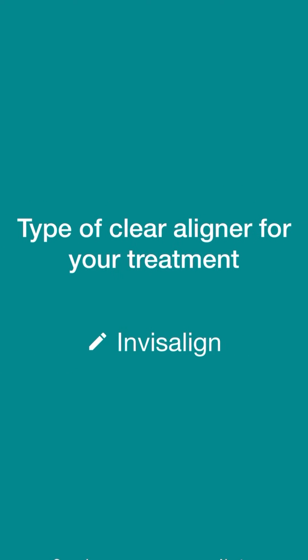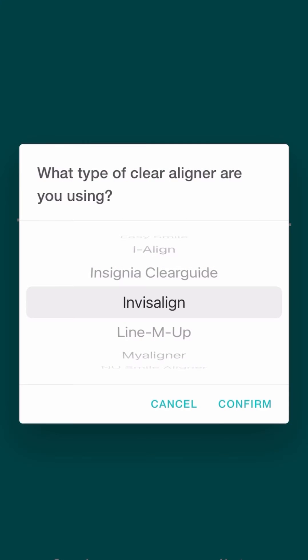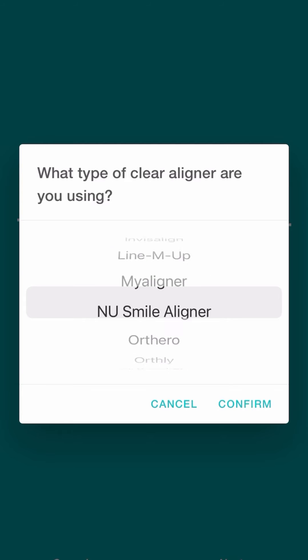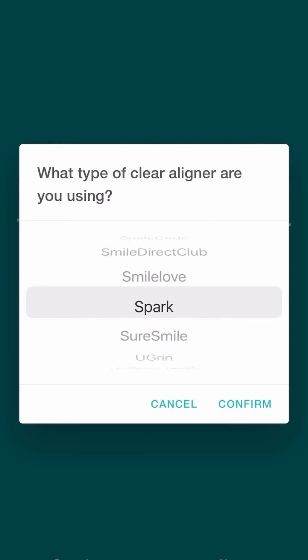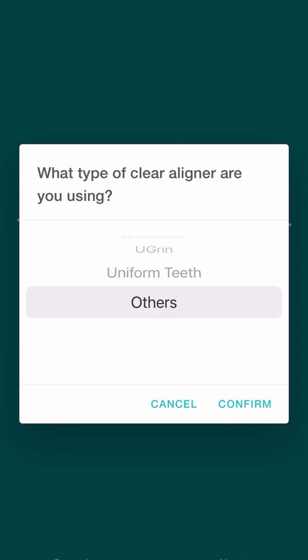This is where you select your clear aligner brand. To find the clear aligner, just scroll through. If you can't find your aligner brand, just select Other.